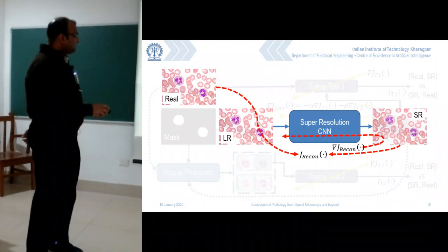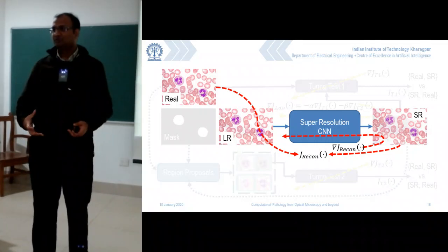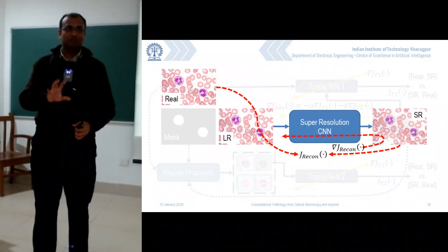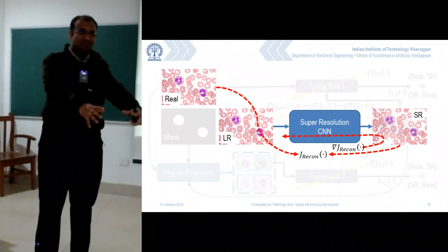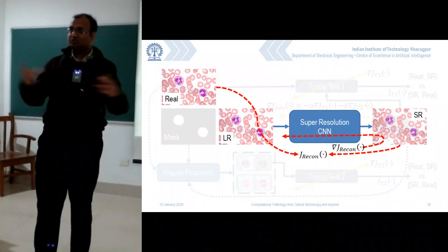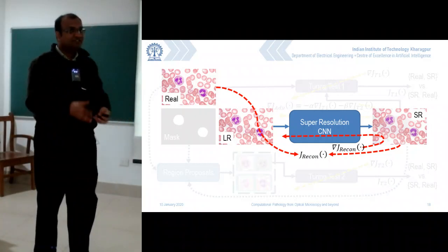Now the point is, this CNN is not something which you can just buy off the shelf, or something where you can write your own code and do it. It has something called a trainable set of weights, and this has to be taken care of, and that's not a trivial problem, that's a bigger problem. So what this leads to is, I told you that different regions will have different neighborhood characteristics, and given a large amount of data I should be able to relate that and create this knowledge base. So training a CNN is essentially going to do that.